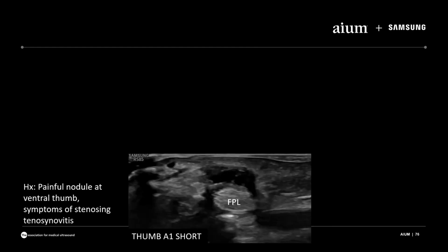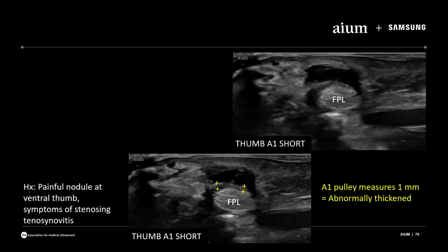Now, here's a variant of a ganglion cyst. This patient presented with a painful nodule at their ventral thumb, and they had symptoms of trigger thumb, stenosing tenosynovitis. So here we are imaging the A1 pulley of the thumb in short axis. You can see the A1 pulley there is thickened. Remember, it shouldn't measure over 0.5 millimeters. So that's consistent with the history. But we also notice that there's this cystic area that we can bring out a little bit better when we angle.